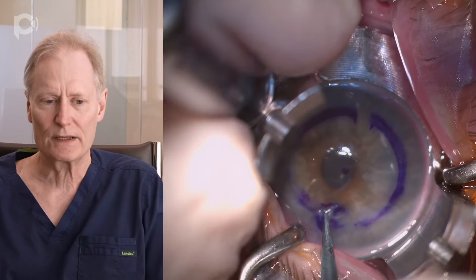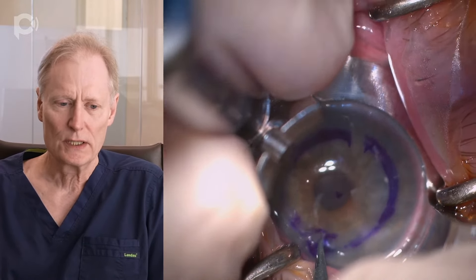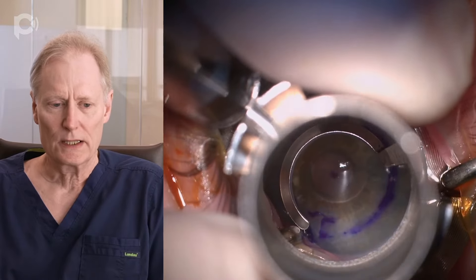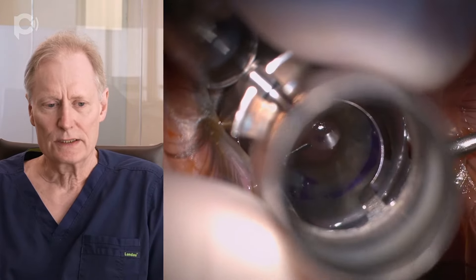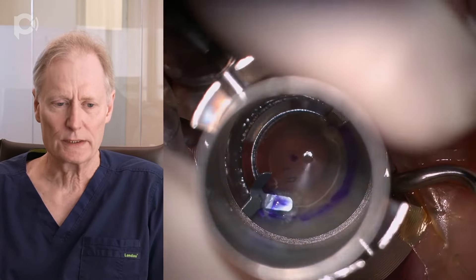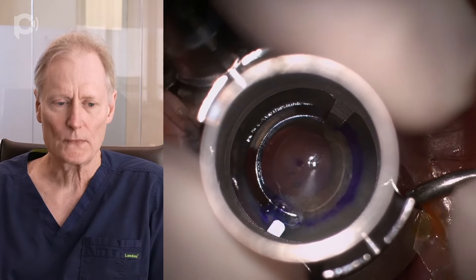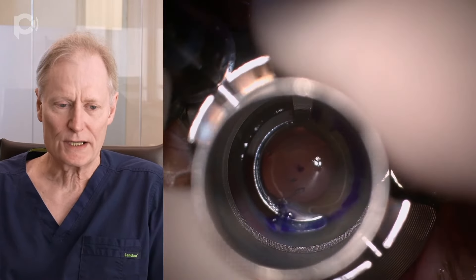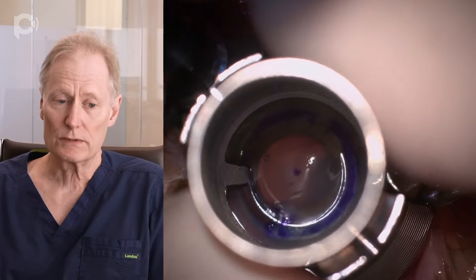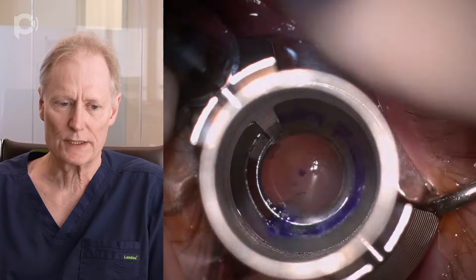Now this patient does not have a big fissure so it's a little bit of a tight squeeze, but even with such a patient in the office we can create a little pocket with a dissector and then just thread this lamellar dissector between the collagen layers in this patient's cornea. This blunt dissection we think gives the cornea the maximum amount of strength, which is really what we want to do in keratoconus — make sure that we don't compromise the strength of the patient's cornea.